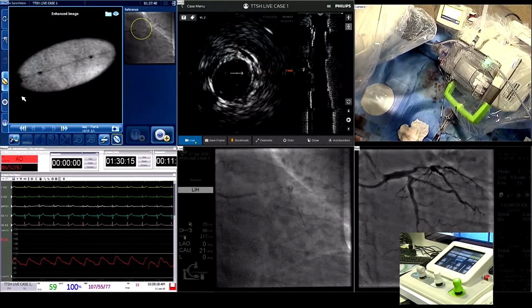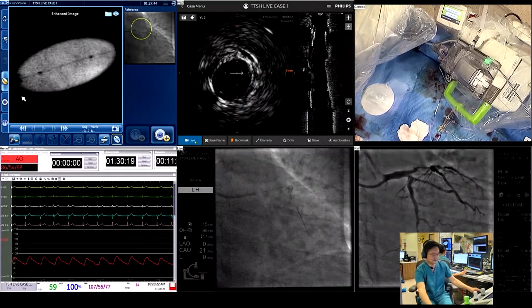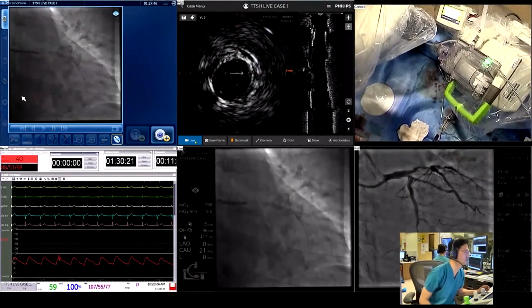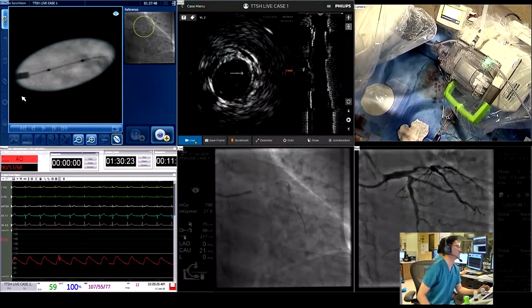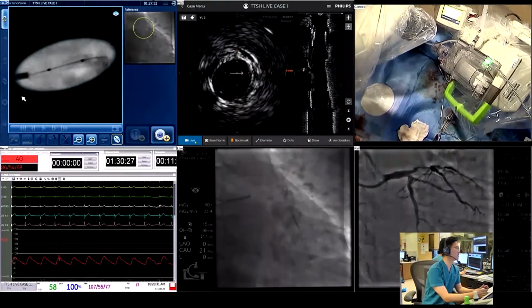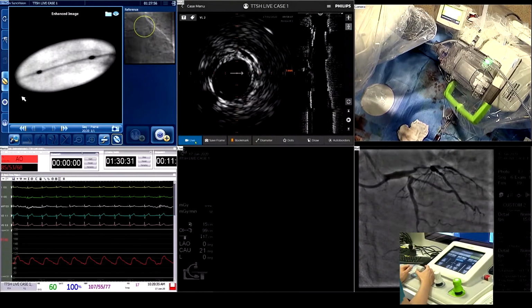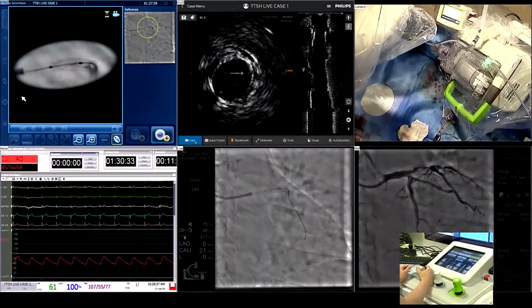That's something like the price of a stent, am I right? It's more or less the same as a stent. Yeah, that's right. So at the moment, fortunately, the patient still gets some subsidy, and sometimes we package it with the stents or balloons to reduce the cost.